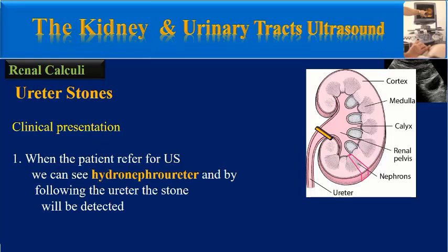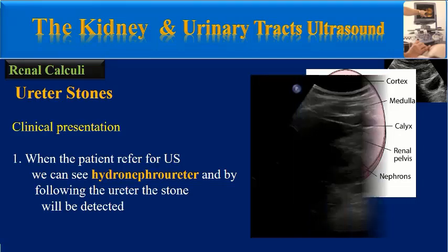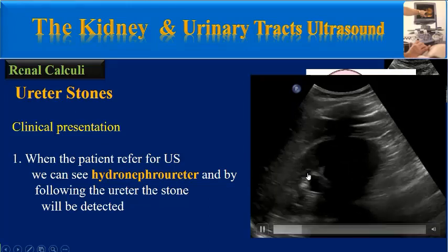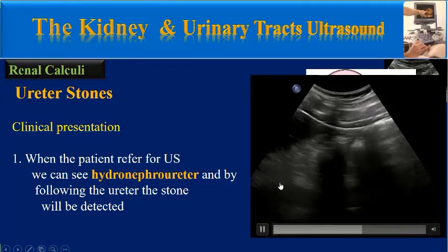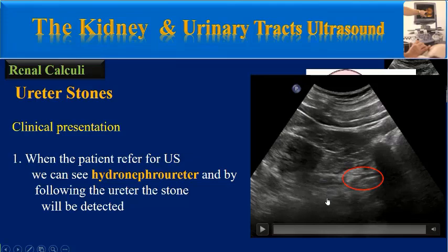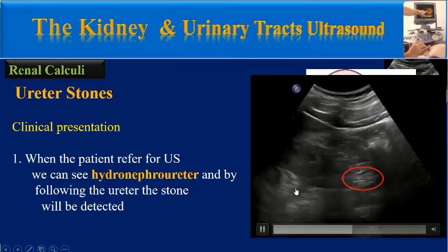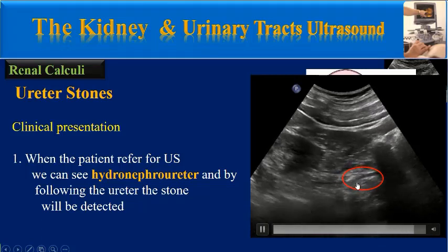When the patient is referred for ultrasound, we can see hydronephroureter, and by following the ureter, the stone will be detected. As you can see in this clip, this is hydronephrosis and this is the stone. Another one, hydronephrosis, hydroureter, and the stone.